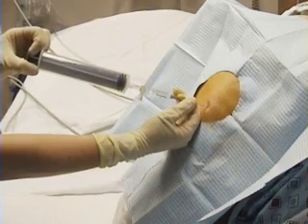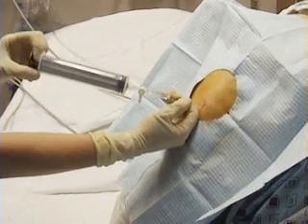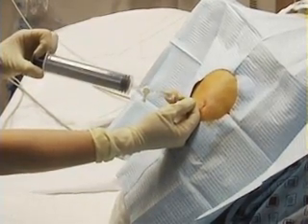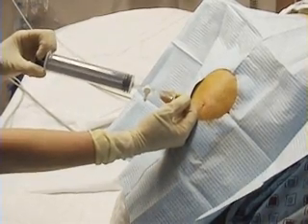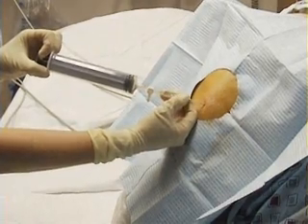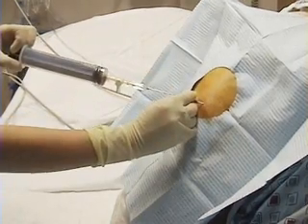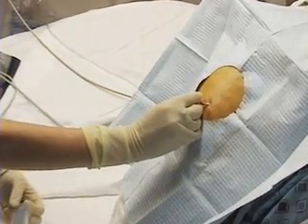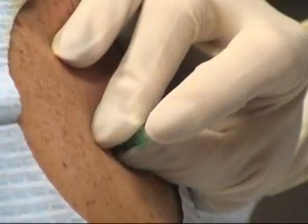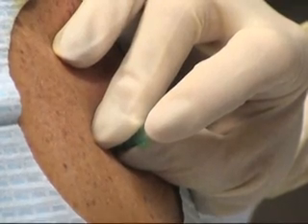Attach an 18 gauge over-the-needle catheter to a syringe and advance it along the superior surface of the rib. Keep pulling back on the plunger as you proceed to the predetermined depth of the pleural space. Once fluid is aspirated, immediately stop advancing the needle and guide the plastic catheter over the needle. When the catheter is fully inserted, remove the needle as the patient exhales or hums. The exposed hub of the catheter should be covered immediately with your finger to prevent the entry of air into the pleural space.